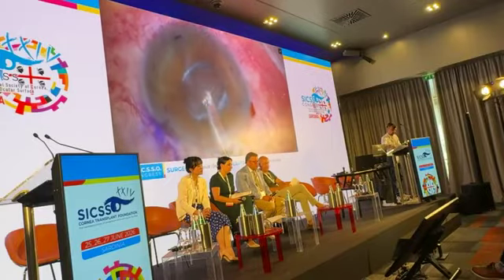Now he is carefully washing the viscoelastic from the anterior chamber, because in the next phases of the surgery, of course, we don't want to have any residual viscoelastic inside the anterior chamber. So there is this phase of careful washing, also repeat washing, to be sure that no residual will be left in the anterior chamber.